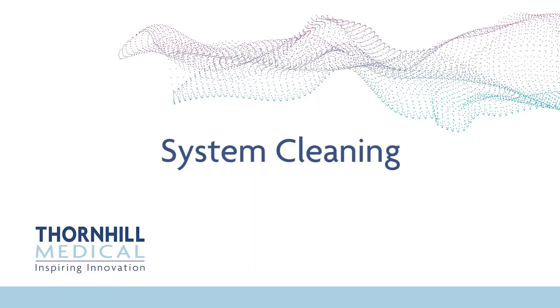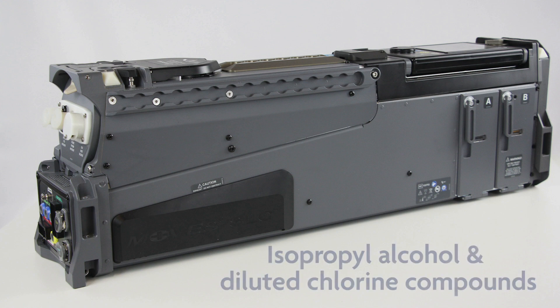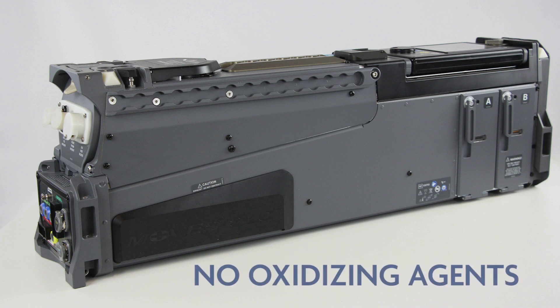System Cleaning. The external body of MOVES SLC can be cleaned after each use and during routine maintenance using standard cleaning agents such as isopropyl alcohol or diluted chlorine compounds. Oxidizing agents should not be used for cleaning.